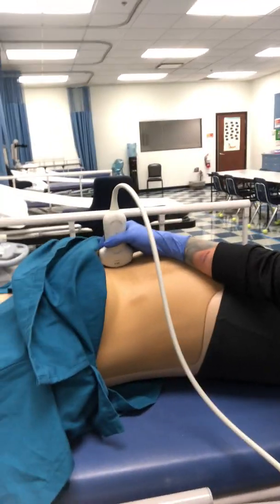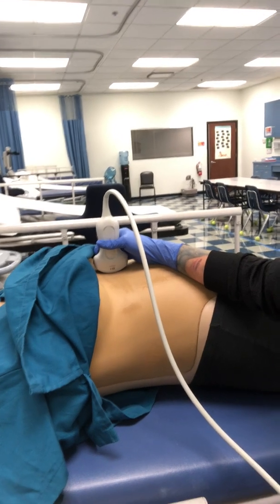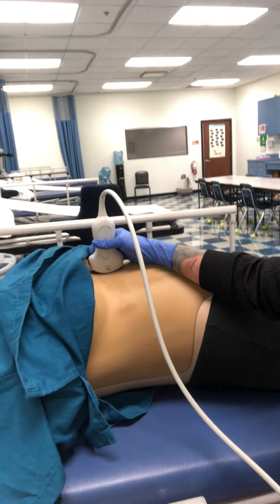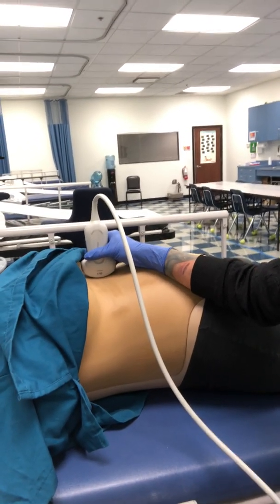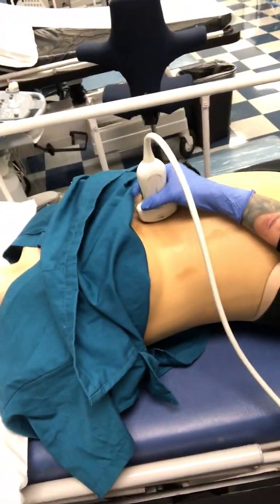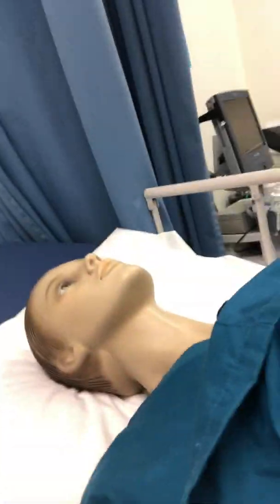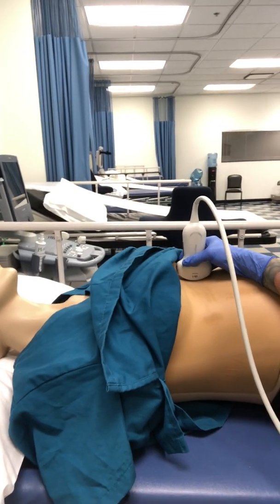And you need to make sure that if you do not understand, you are reaching out to me versus me finding out on a quiz that you aren't really sure of what everything means as far as orientation goes. So right now we're in a sagittal or long cut of the abdomen, and you can see here my notch is pointing towards the patient's head. So that means, again, I'm in a sagittal position.